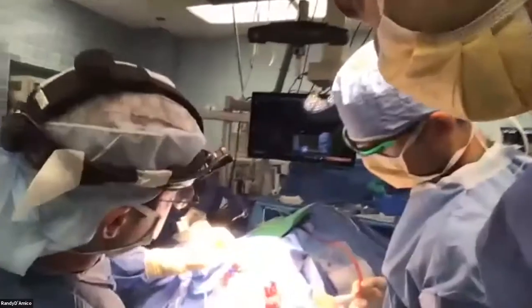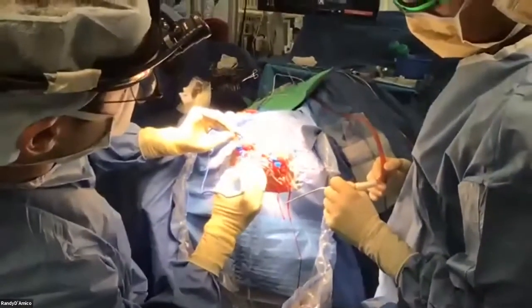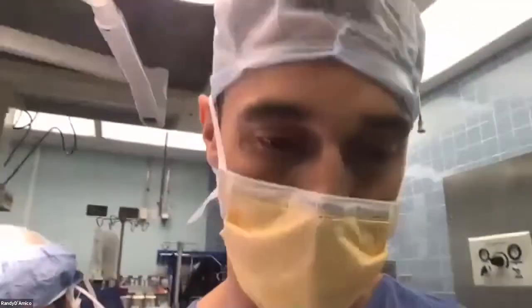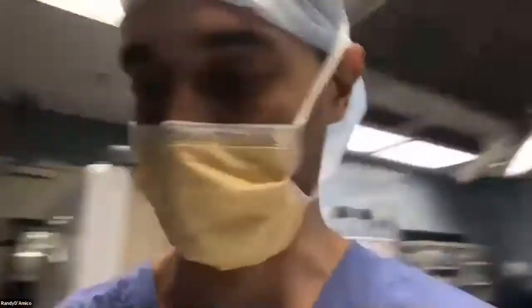All right, guys, so what we're going to do now is come inside. You can see that actually surgery started. And so they've done an incision, all right? And I don't know if you guys can see that there. And they're preserving a lining on the covering of the bone called the pericranium. Pericranium will be used at the end of the case to help with a watertight closure.